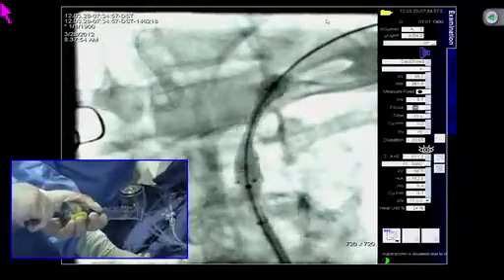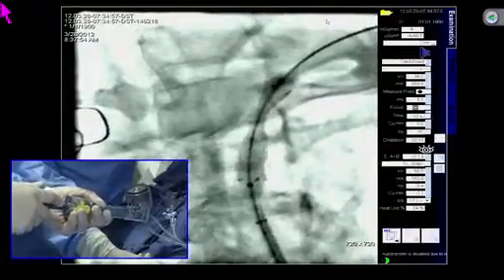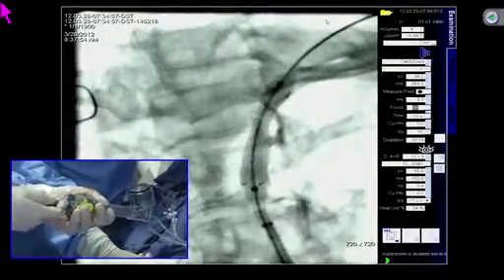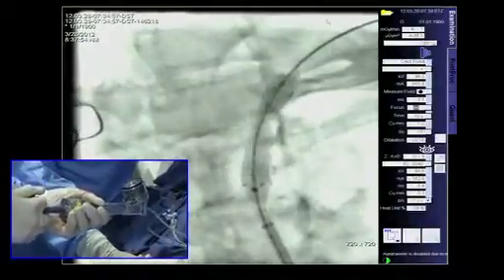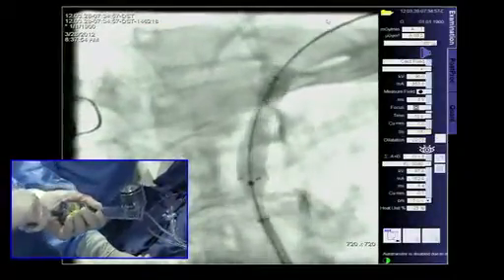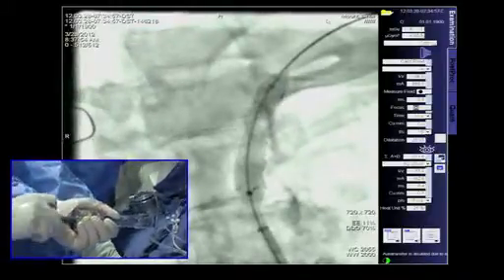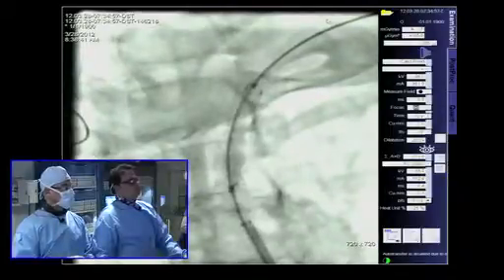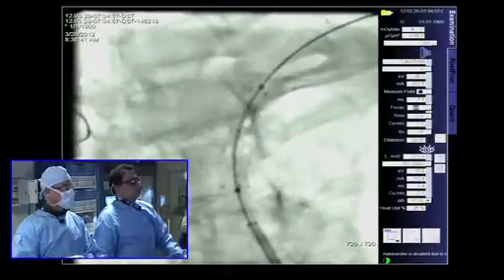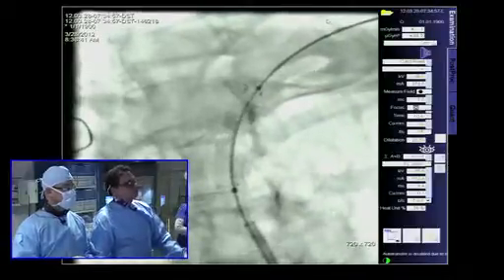And now, see how big it is, the 7. I think it was a very good size, 7 by 27, and you see now you can see where the tight spot of the lesion is, and we're kind of covering 2/3, 1/3 that spot very appropriately. We have nailed both the proximal and distal reference segment.